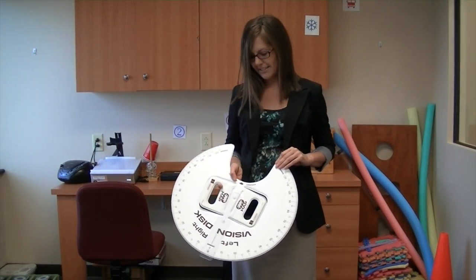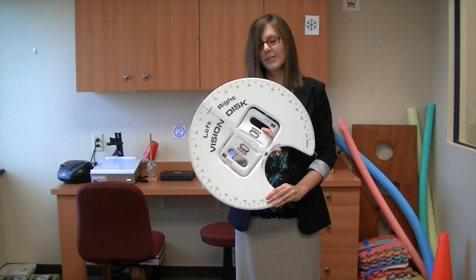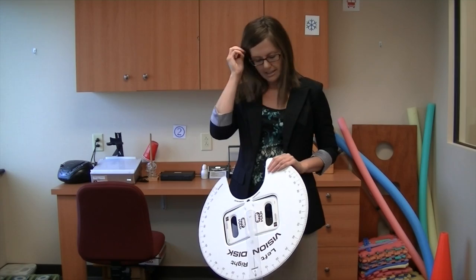Hi, I'm Dr. Julie Steineller and today I'd like to talk to you about a vision disc. This cool little gadget we use in testing with some of our patients, and it looks kind of crazy.